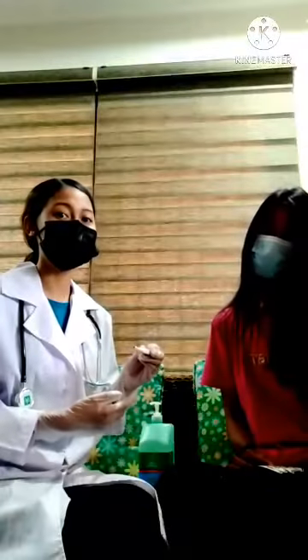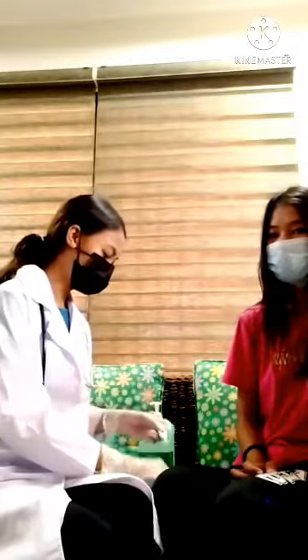And then after that, note the temperature reading of your client. And then return the thermometer to the appropriate storage place, and then return the electronic unit to its charging unit. And then after that, perform hand hygiene and remove the gloves. And don't forget to note it in the client's record.